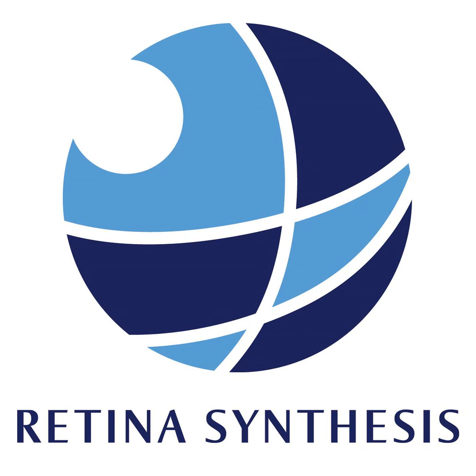And in our feasibility study, there was agreement between Jeff Heyer and I and the home OCT about which eyes had fluid and which eyes didn't have fluid. And where we disagreed is that the home OCT could see minute amounts of fluid, like 4 nanoliters of fluid, that quite frankly, Jeff and I couldn't see. But when we went back to those scans and looked, you could see why the computer said it was 4 nanoliters of fluid. Now, I don't know if that amount of fluid is actionable, but every physician might set up their own parameters, and it may be very individualized to the patient as well. So setting parameters is pie in the sky right now, but this technology has every capability of doing that.